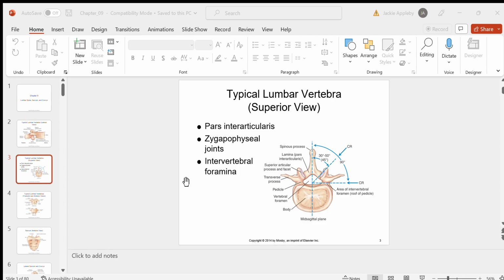It's your goal, as we learned last time, to make sure the patient is not rotated when you have them on the table for these AP projections. What plane of the body for the AP projection needs to be perpendicular to the table? Mid-sagittal plane, right? They're laying on their back, a mid-sagittal plane running a midline down their body, that, if they're laying flat on their back, will be perpendicular, straight up and down to the tabletop, okay? So in the AP projection, we're making sure the mid-sagittal plane is perpendicular to the table.